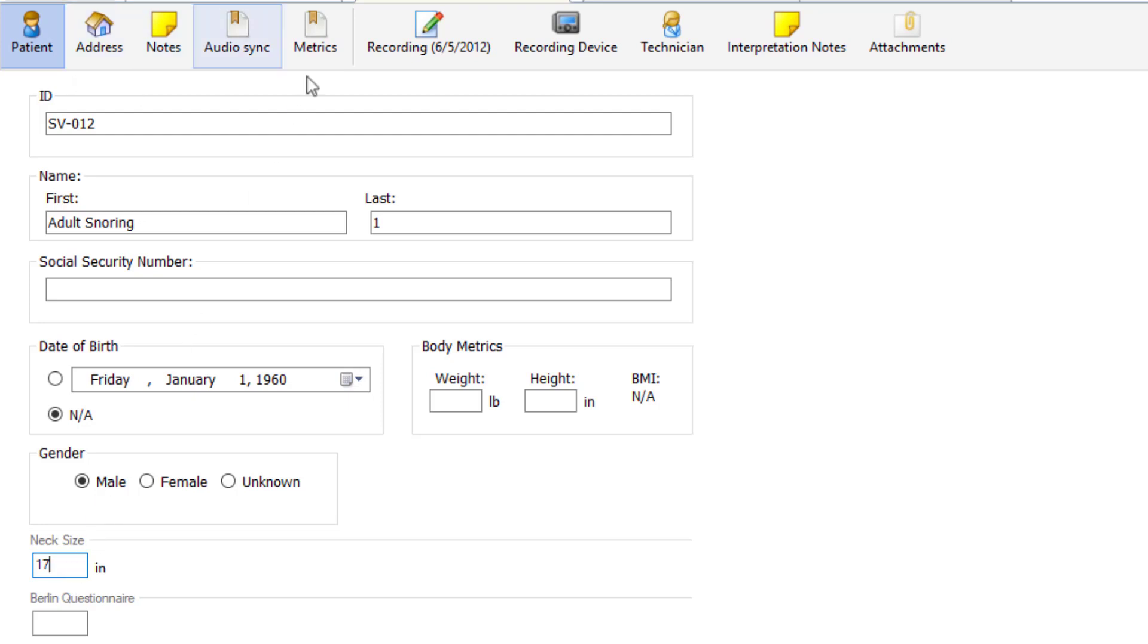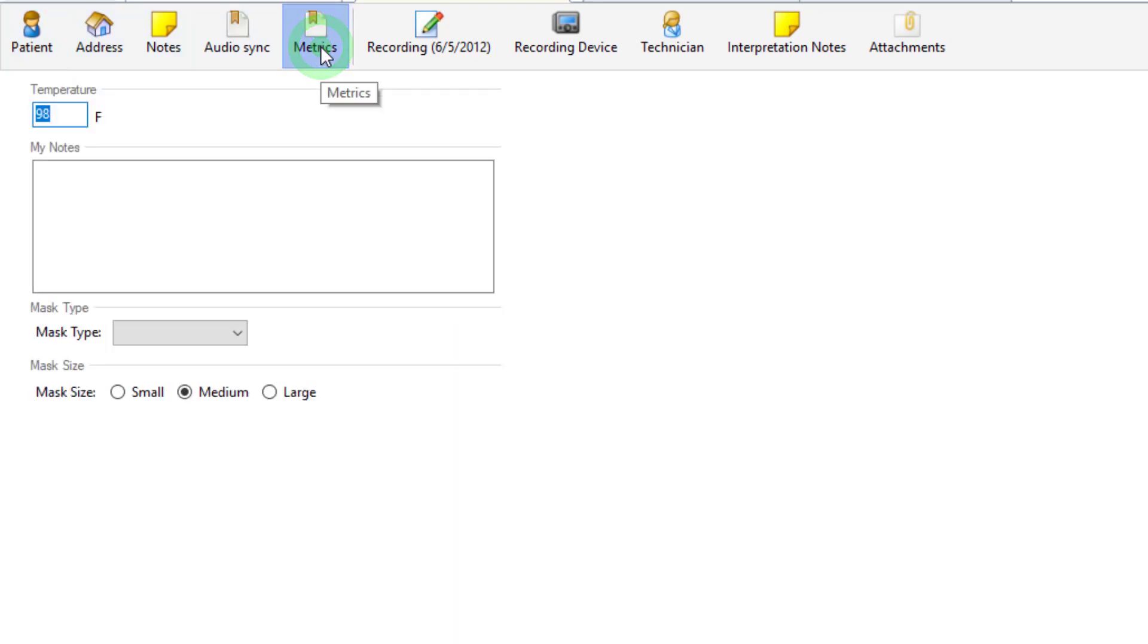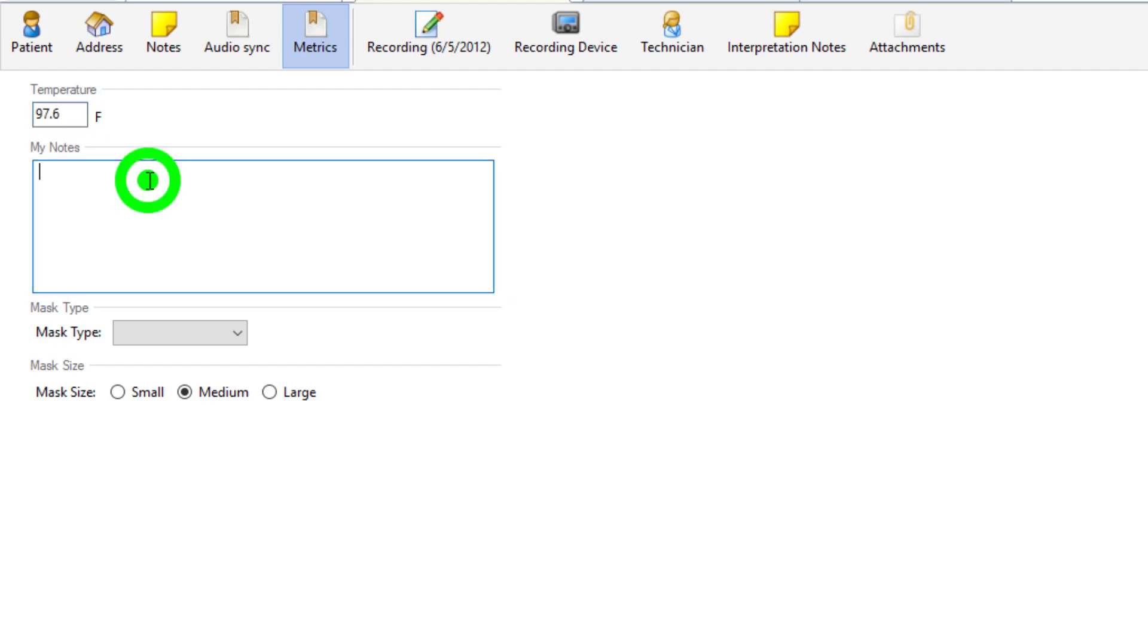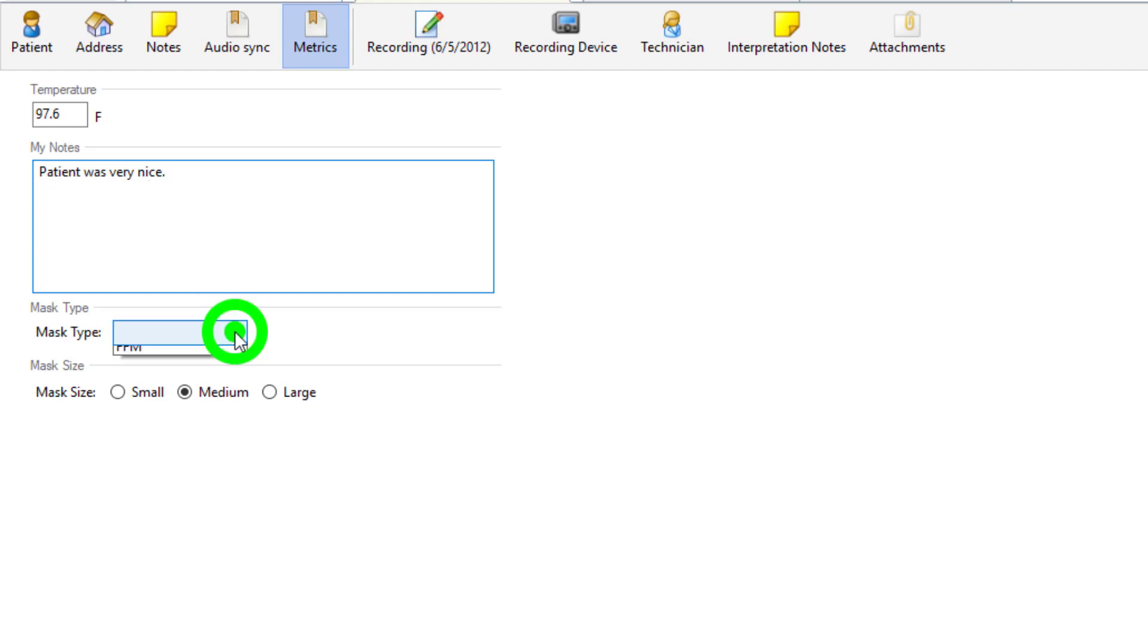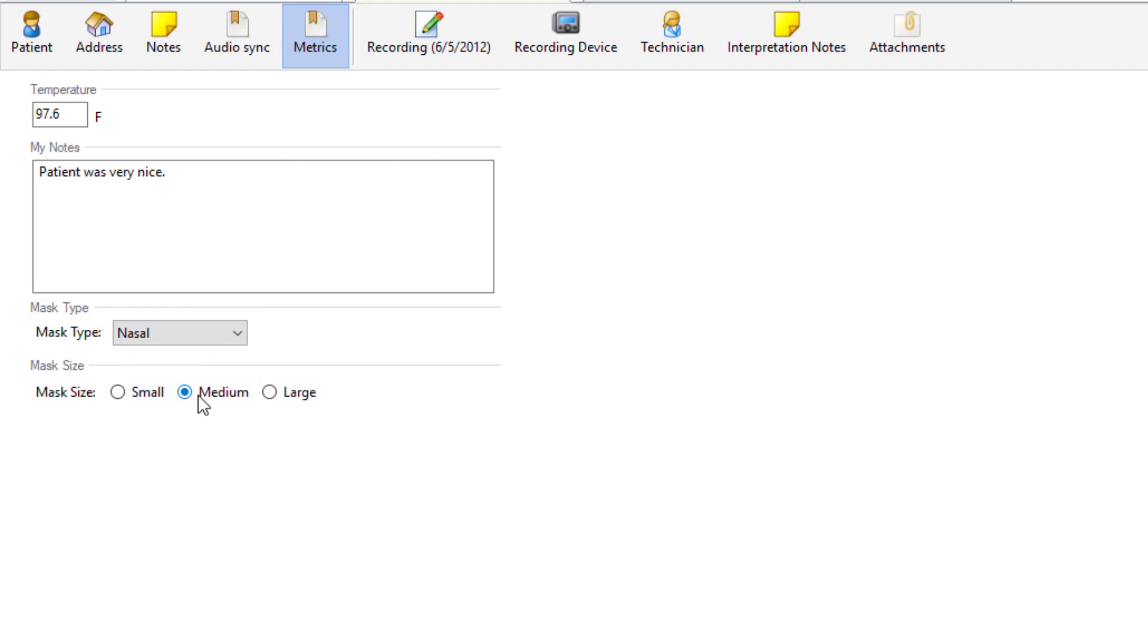And you also see that we have a tab called metrics. We have our temperature that defaulted to 98 degrees. Let's say that this patient was at 97.6. We can edit that information. For notes we can type in any patient information that we would like to. Then we can select our mask type. We'll say that he was on a nasal mask. And instead of leaving that at medium we'll select large for this patient.